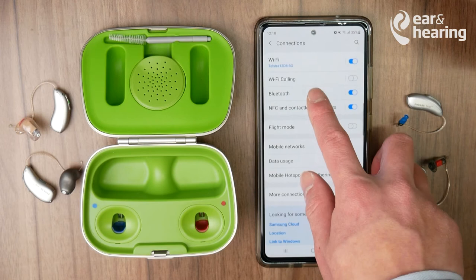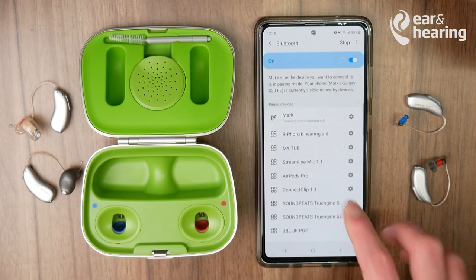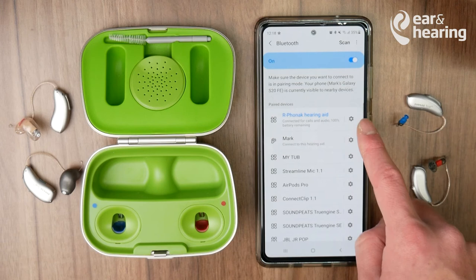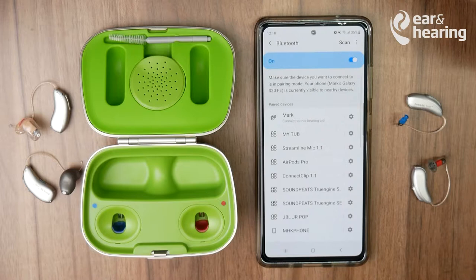Go into Connections, then into Bluetooth. After a few seconds, the Phonak hearing aid should appear. If it doesn't appear, just quickly click on it and you'll see that it's now connected. If you ever want to forget it, click on the settings cog next to the Phonak hearing aid and press Unpair.